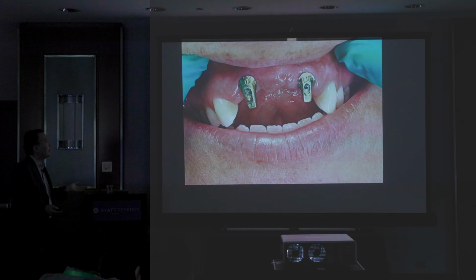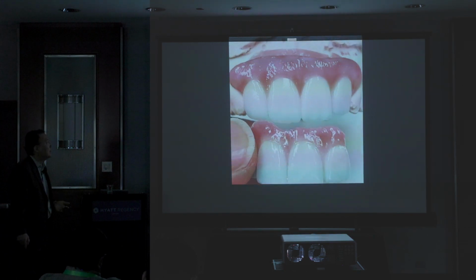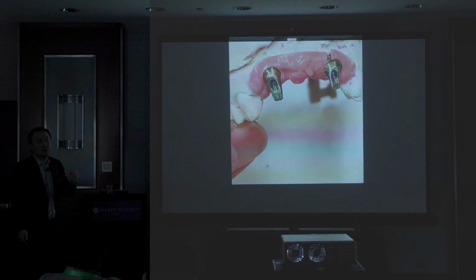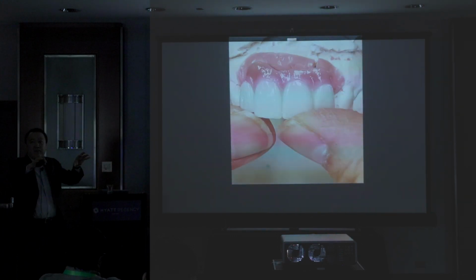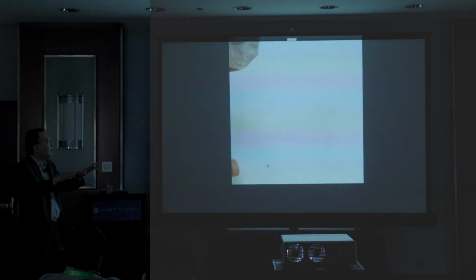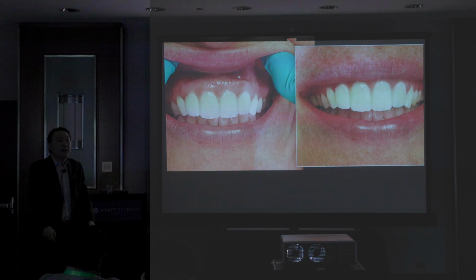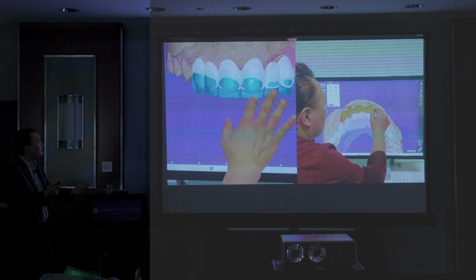Well, as the solution they want to make it metal. I said monolithic zirconia is better compared to both metal ceramic and layered zirconia. The tone is different. You know, metal ceramic compared to zirconia ceramic is kind of a little greenish color and also a different value. So I choose the monolithic because of the strength. The more funny thing is she sent me a photo, the hair is wrapped around. Here's my question, how can they clean? Patients love it, right? Love it. But my question, well, I don't know what they're going to do, right? How can they clean in the future?